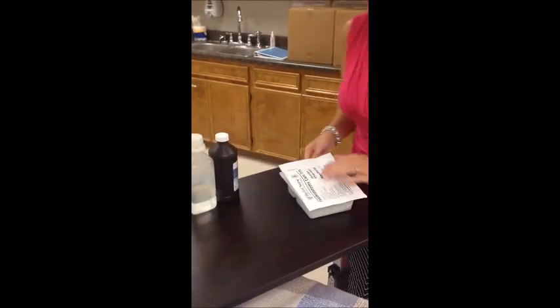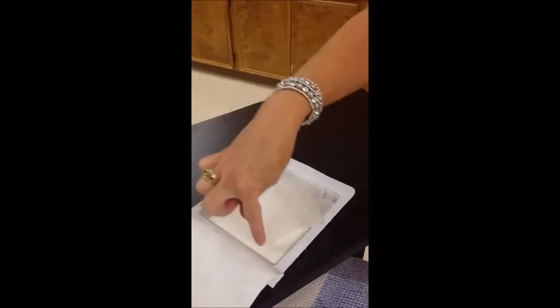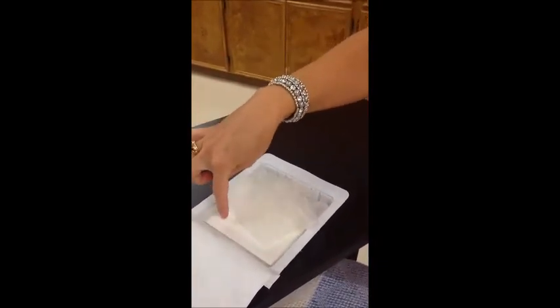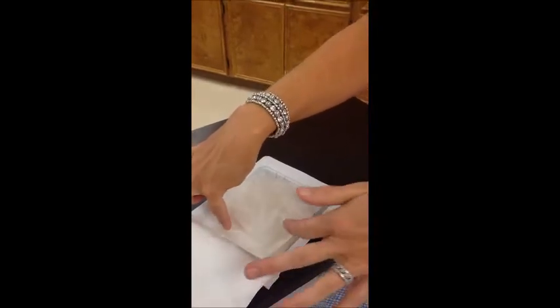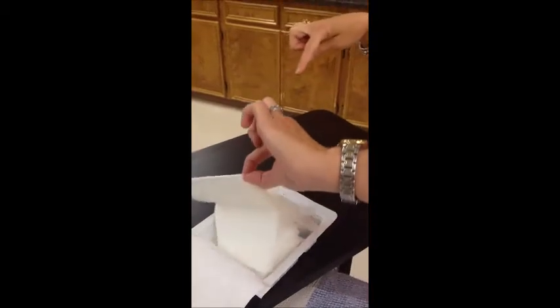Okay, so I'm going to open my kit. As you can see in this kit, your sterile gloves are in the way. There's lots of different ways that we could do this, but your faculty has decided the way that we want you to do this for your checkoffs is to try to get this drape out without touching the box and without touching those gloves. So you can push down and grab your drape and come out.